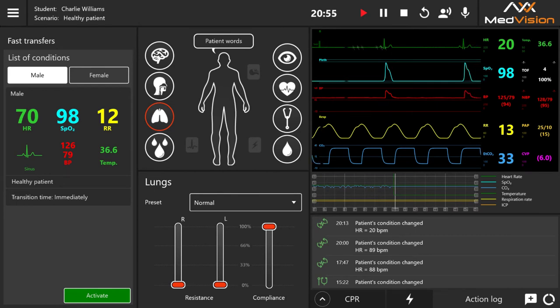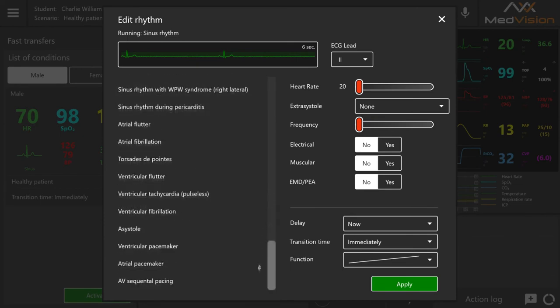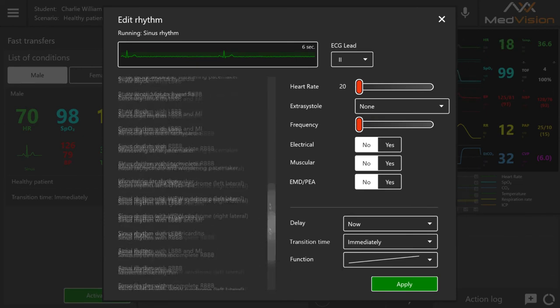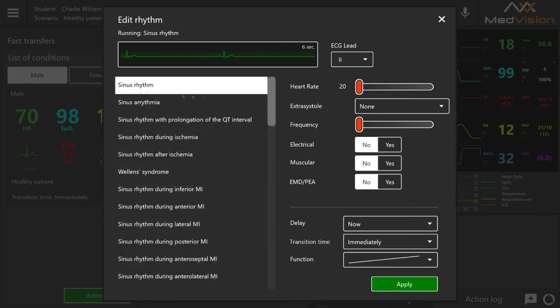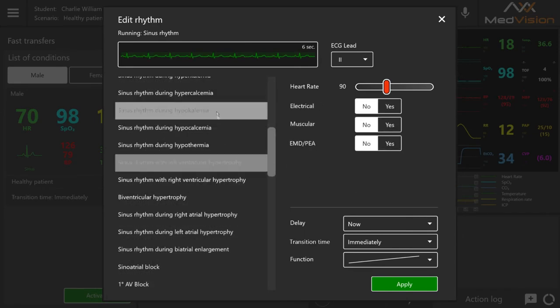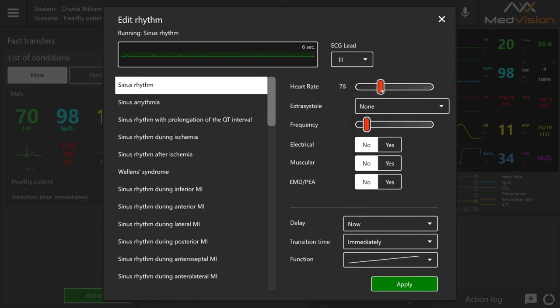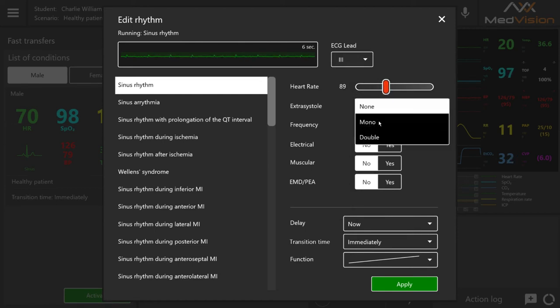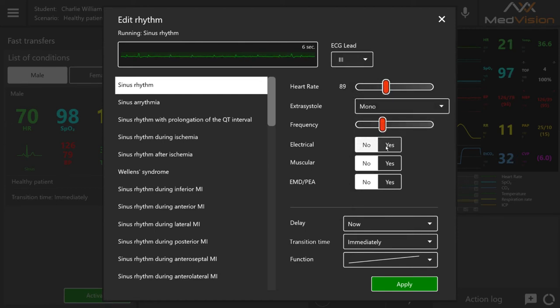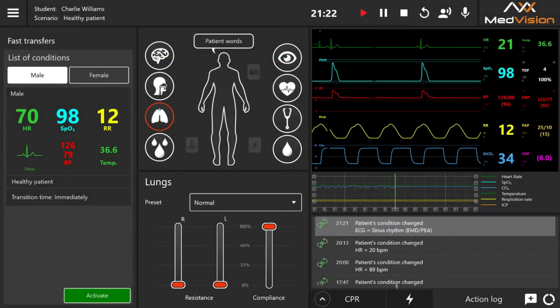Pressing on the ECG in the patient monitor control section lets you choose a rhythm from a library — with asystole at the bottom and sinus rhythm at the top, you can choose between different rhythms and configure them further: selecting a lead, setting a heart rate, extra systoles, frequency, electrical and muscular parameters, EMD/PEA, and then set delay, transition time, and transition function before pressing apply.